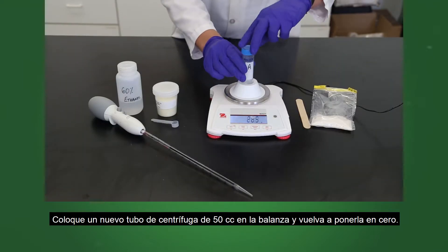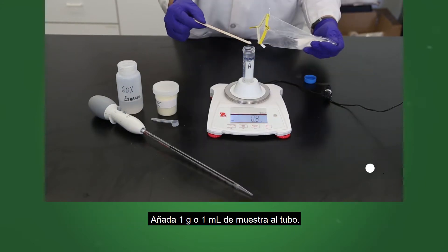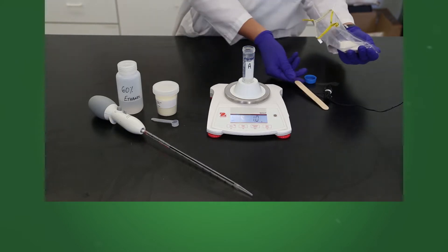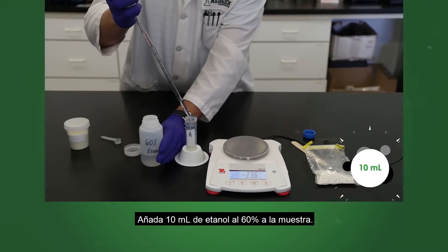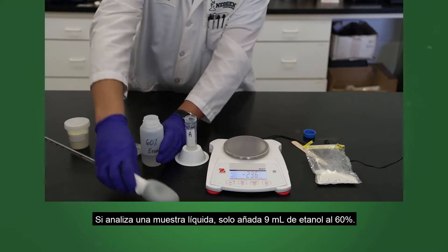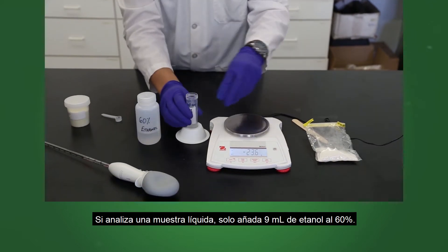Place a new 50 cc centrifuge tube on the scale and zero out. Add 1 gram or 1 milliliter of sample to the tube. Add 1 level scoop of extraction additive to the tube. Add 10 milliliters of 60% ethanol to the sample. If testing a liquid sample, only add 9 milliliters of 60% ethanol.